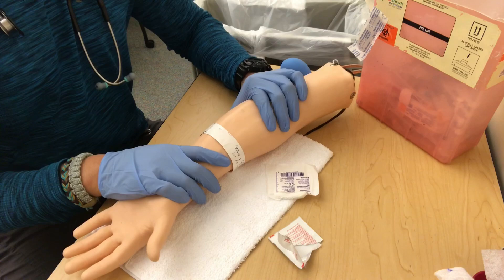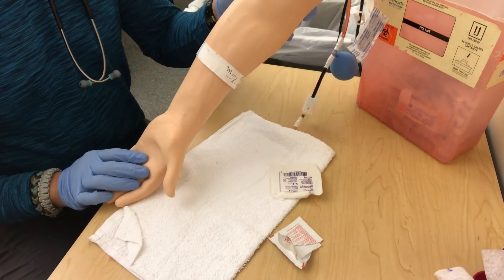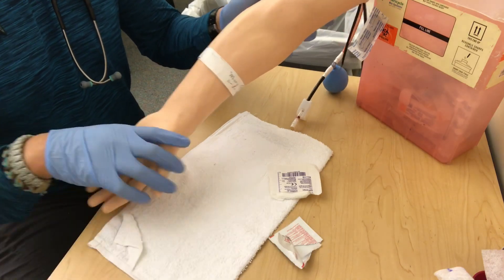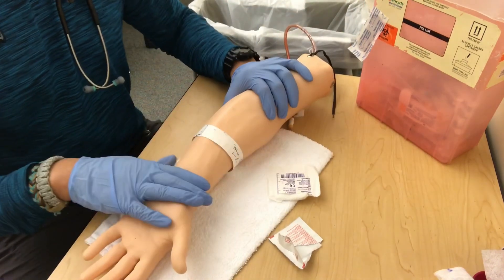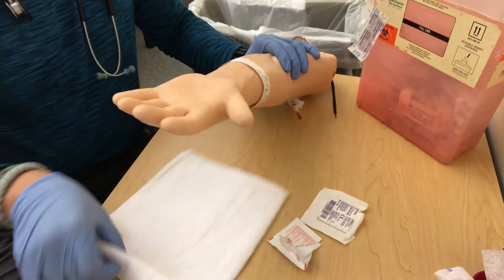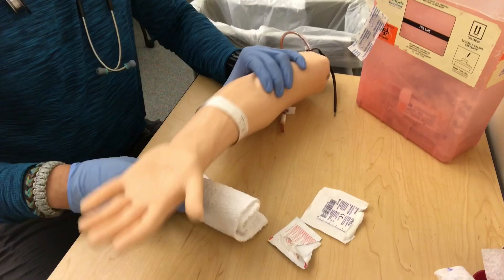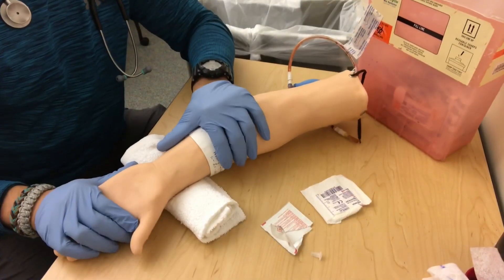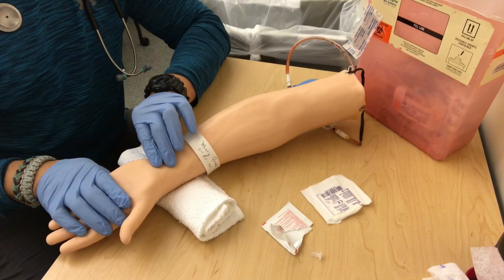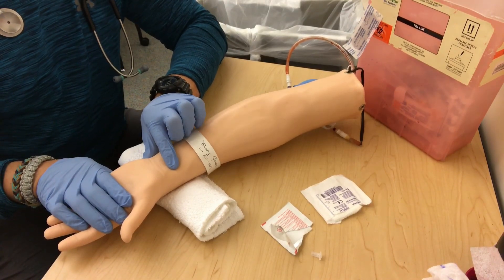Use gravity if you can get the arm down to improve your chances. You also want the skin taut — as tight as possible. You can roll up a little towel under the wrist. We have our patient positioned, skin nice and taut, gravity used, and we've found the strongest pulse and know exactly where we're going to poke.